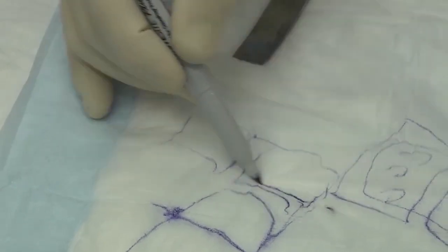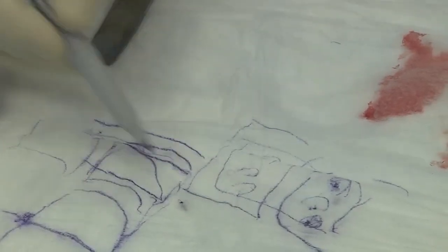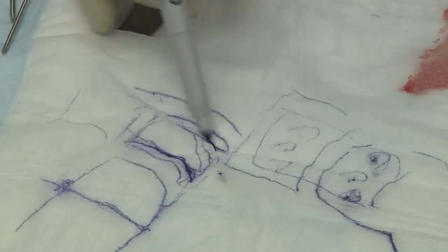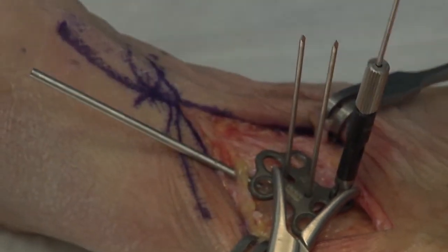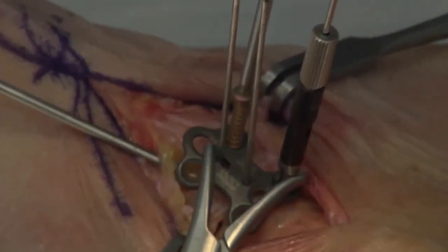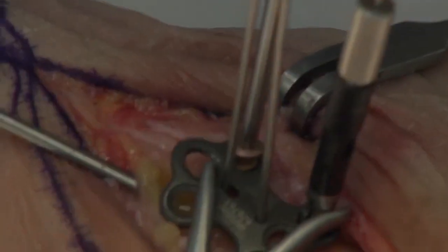In the navicular, you have the cuboid over here, so it's not as important in the navicular to engage that lateral cortex. You also want to be cognizant of the fact that the cuneiform joints further distal, if you're not going to incorporate them into the fusion, need to be avoided. These screws should be directed in a way that accommodates the concave surface of the proximal navicular but avoids the convex surface of the distal navicular. The plate is designed to allow you to do that. We'll go ahead and place a navicular screw.